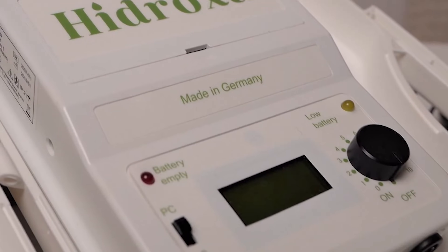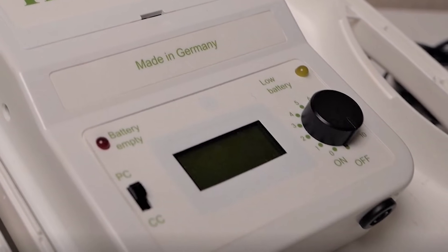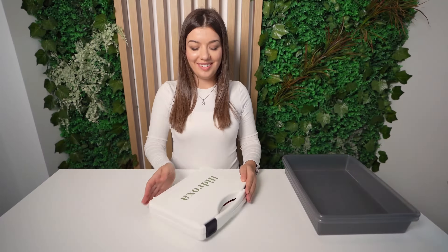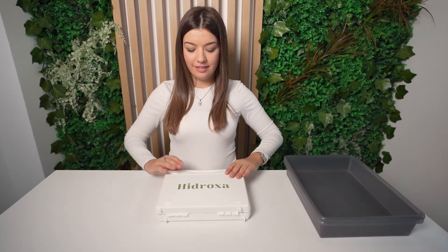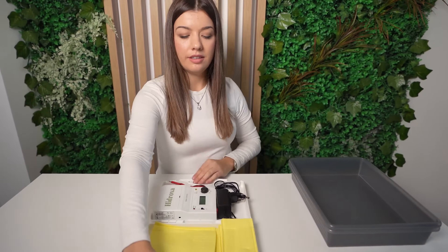During iontophoresis treatment, a medical device is used to pass a mild electrical current through the water while your affected body part is submerged in water. There are no significant or serious side effects, and the benefits are long-term when you maintain your treatments regularly. Results can be seen after one to two weeks.